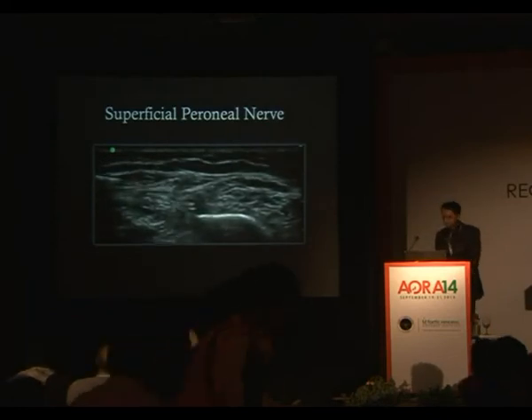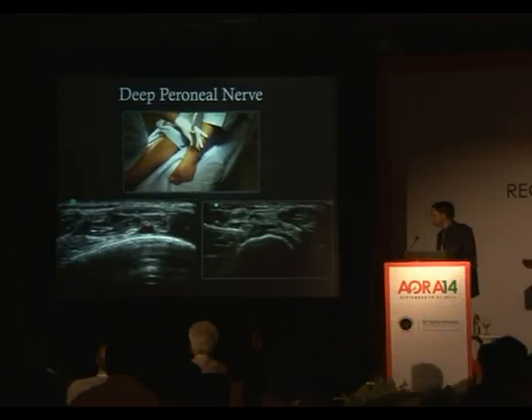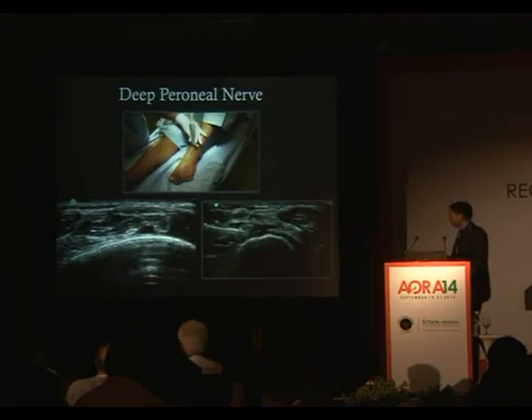That's about it. With the deep peroneal nerve, things get a little bit easier because we're back to spotting an artery. The nerve usually lies just beside it. If you don't see the nerve, it's been described that you can just do injections around the artery to get the deep peroneal nerve. I'll show you a video.